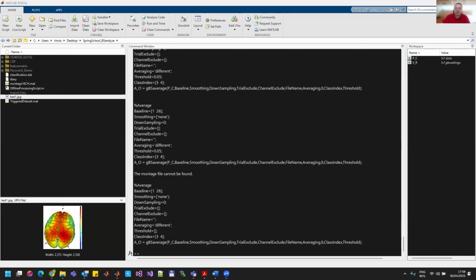After the classifier is created, the user gets visual feedback that the hand is moving if he imagined correctly the right or left hand movement. At the same time, he gets feedback via FES, the stimulation of the according hand, right or left, according to the presented cue.